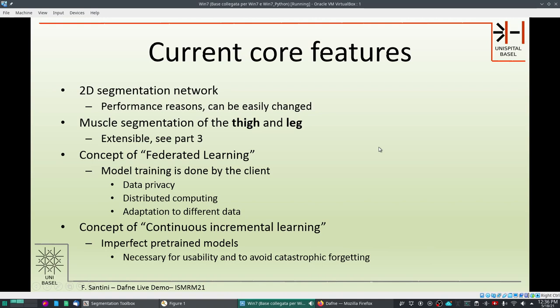The current core features: the neural networks that perform segmentation are two-dimensional networks, mostly for performance reasons, but this can be changed if needed to support organs better segmented in three dimensions. The segmentation networks provided at the moment are muscle segmentation for the muscles of the thigh and of the leg. However, this is extensible and we encourage the community to participate by providing new models and extending the functionality.